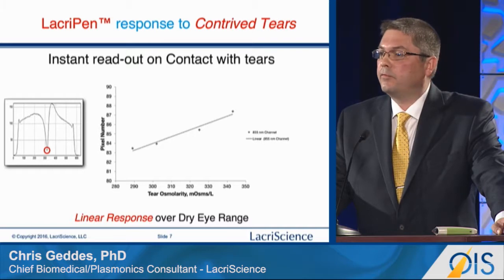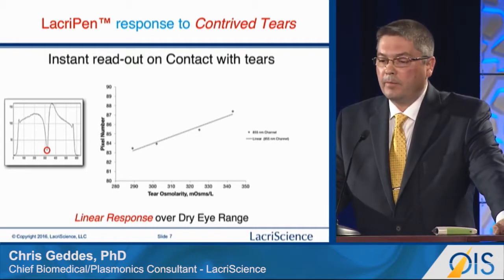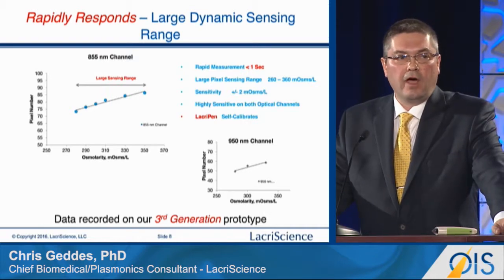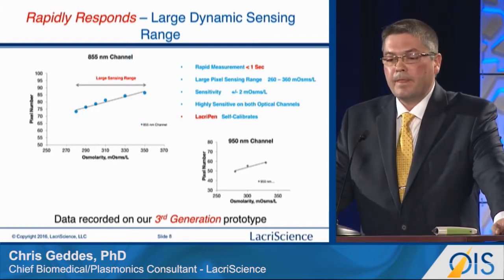Here is a linear response to salt solutions. We can accurately determine the level of salt in a salt solution in about 1 second with a sensitivity of about 2 milliosmoles. Here is some contrived tear data. We use 2 wavelengths in the LacriPen, 855 and 950. We use 2 wavelengths simultaneously so the pen will self-calibrate. We have linear responses in artificial tears in both channels.